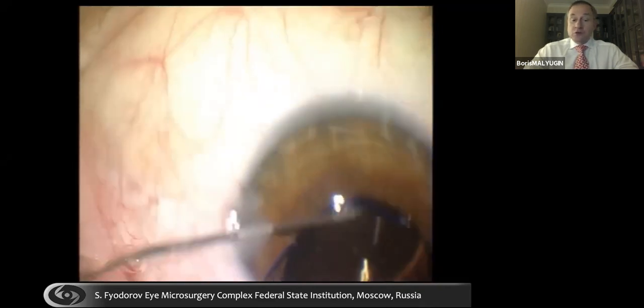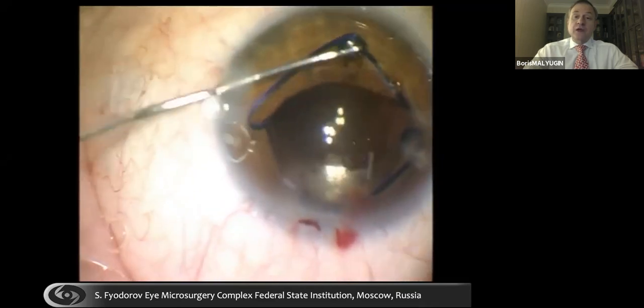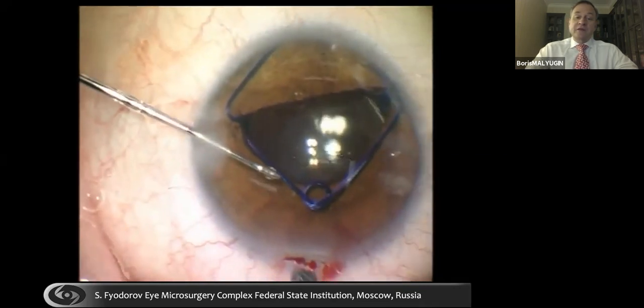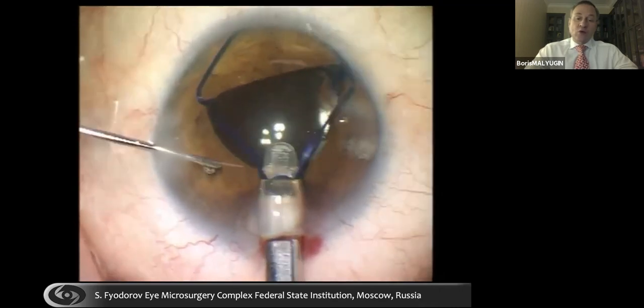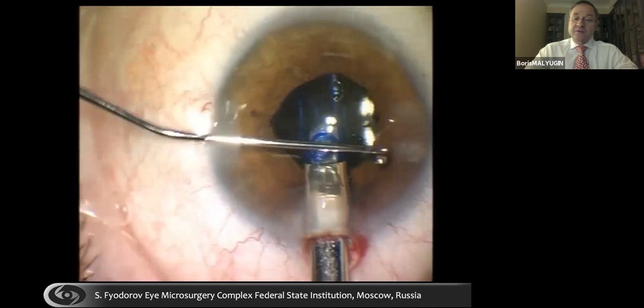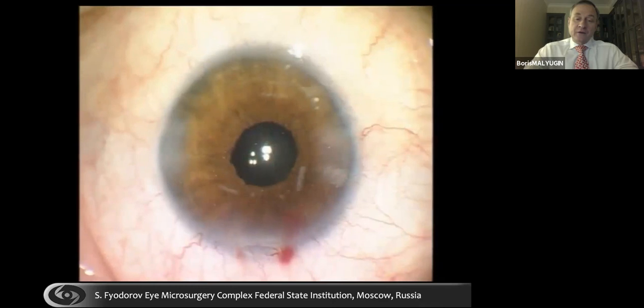Removal is also quite straightforward. You just disengage the distal scroll located contralaterally to the main incision, and lift the proximal scroll a little bit above the iris plane, and then catch this scroll with the hook of the injector device, and then retract it inside the injector tube, as shown here. And at the end of the procedure, you can see that the pupil becomes constricted again. It's very nice and round.